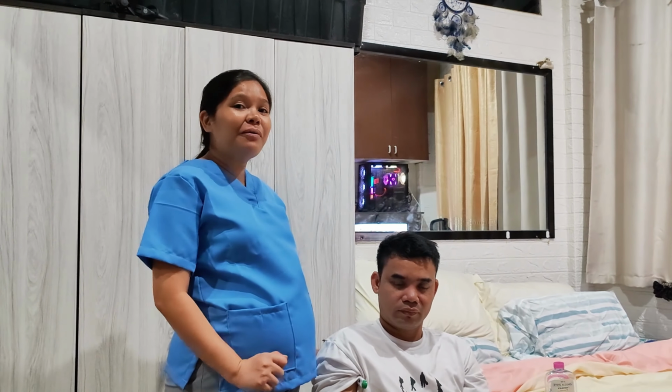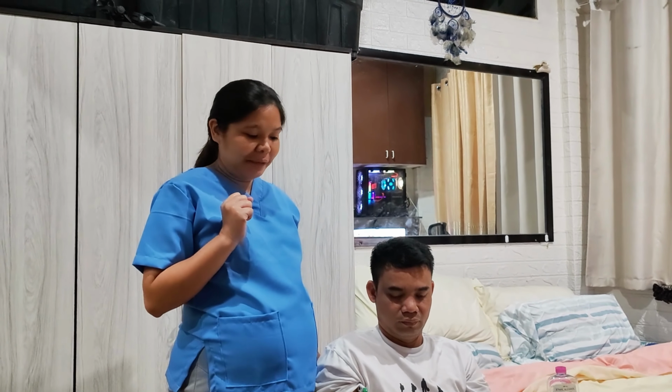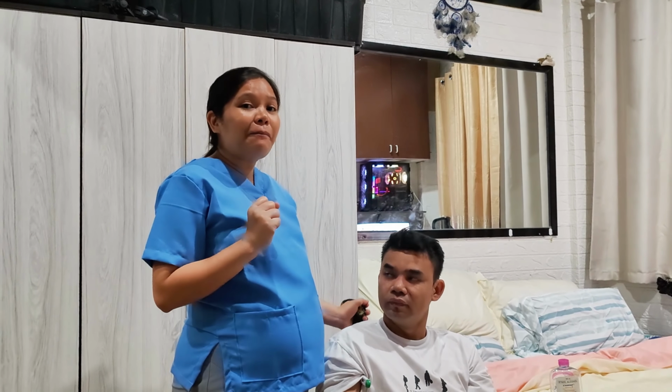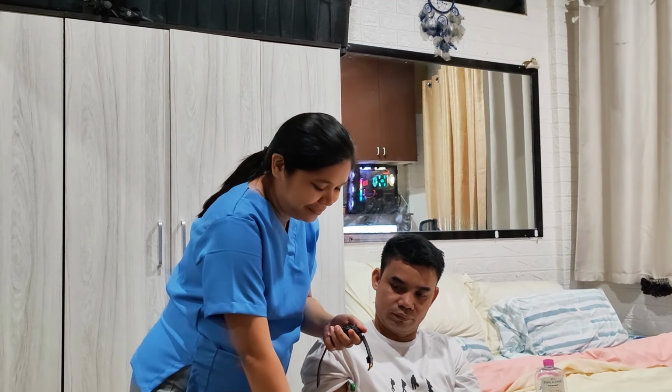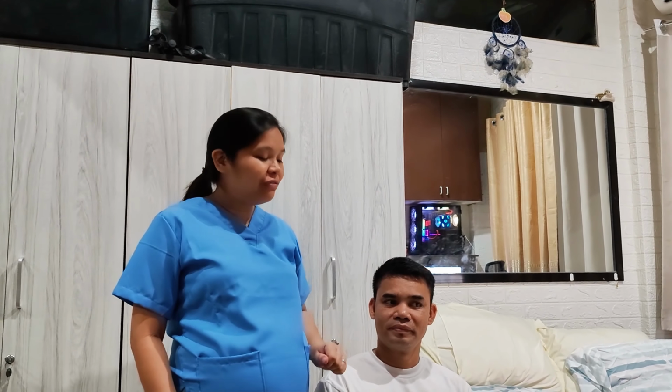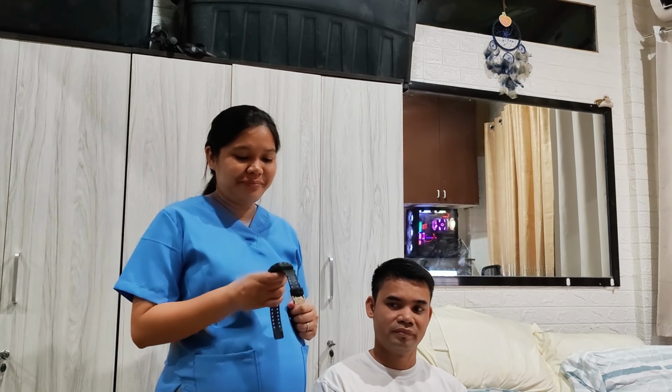While waiting for the thermometer to beep, we will be taking the pulse rate of the patient. If the beat is regular, we will be taking 30 seconds multiplied by 2. If the patient's beat is irregular, we will be taking 1 full minute. So, let's palpate the radial artery of the patient. In taking the respiration rate of the patient, we need to observe the rise and fall of the patient's chest discreetly for 1 full minute.